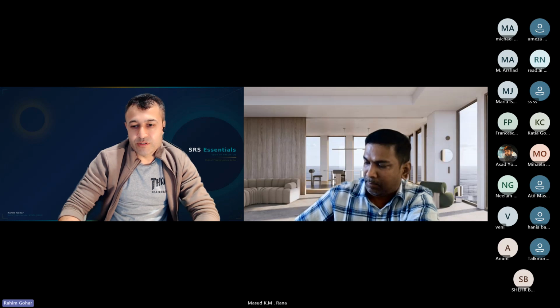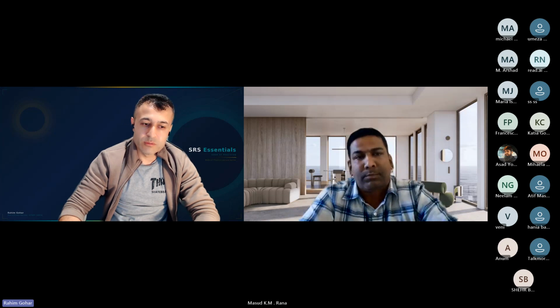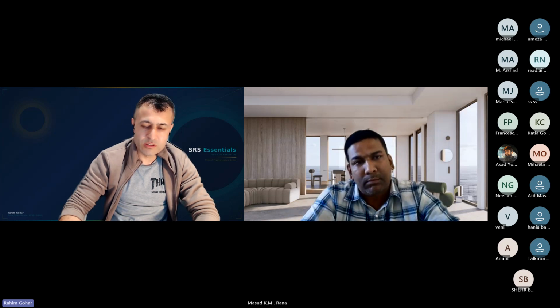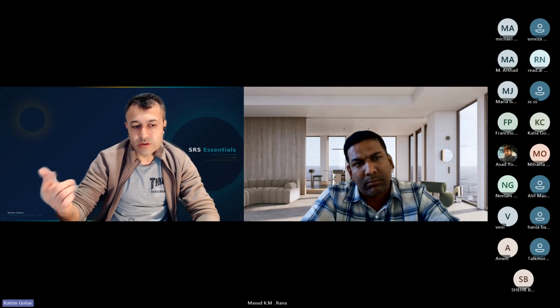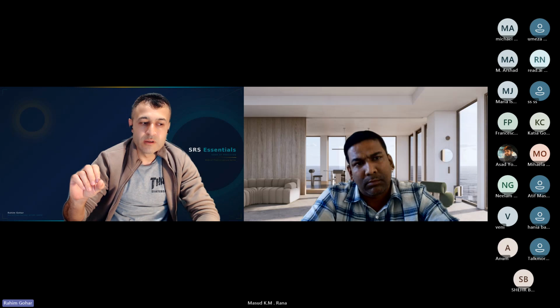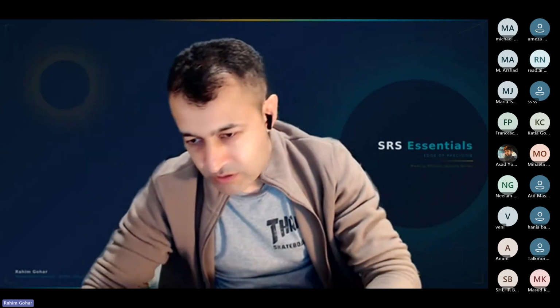Below 8 millimeter, you need to really fine tune your machines in terms of the focal spot and so on, and mechanical accuracy in so many things. So there it breaks. As a physicist, you are the one who is going to determine that minimum. Because as I said, we have a net compliance with varying field sizes and varying complexities, from minimum to maximum. Our PTV sizes start from 8 millimeter and go up to 4 cm.